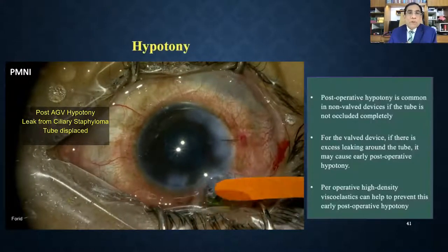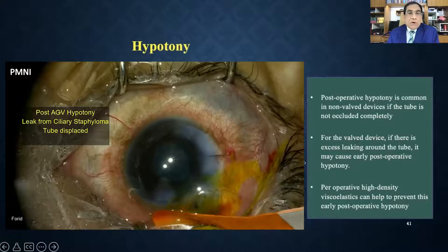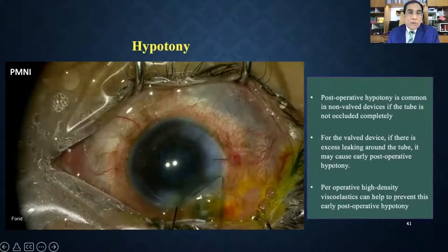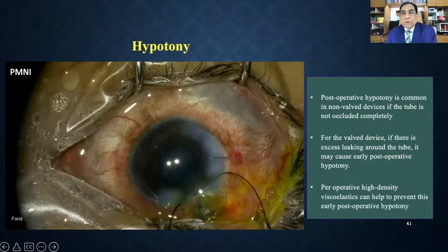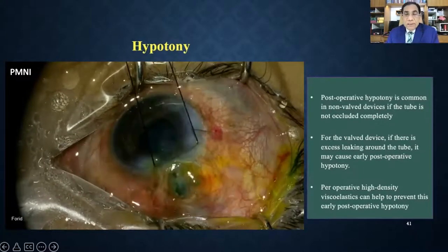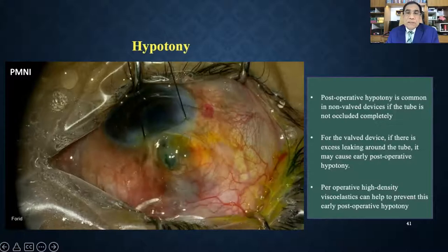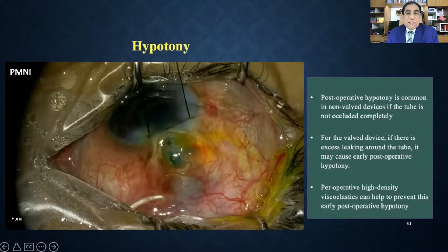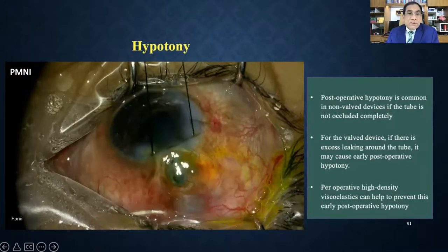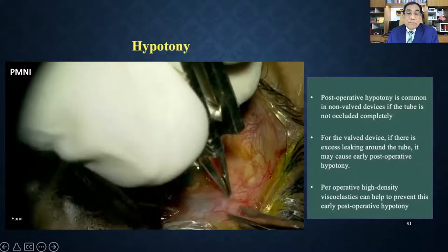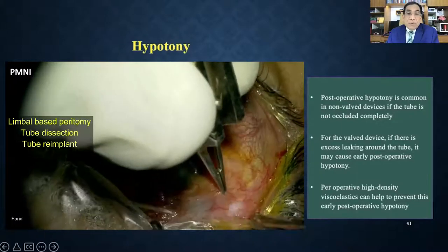Postoperative hypotony is a complication that can occur early or late. In one referred case, there was a ciliary staphyloma and the tube was already extruded. The area must be dissected and the needle track revised to a different location, then covered with donor scleral, corneal, or patch graft — otherwise the tube will extrude again.